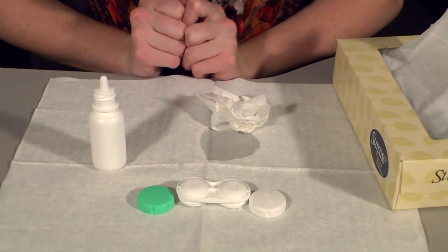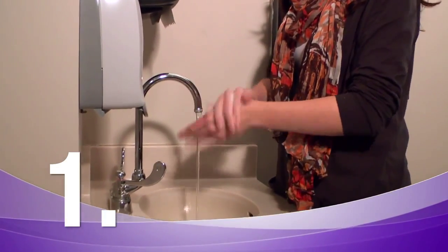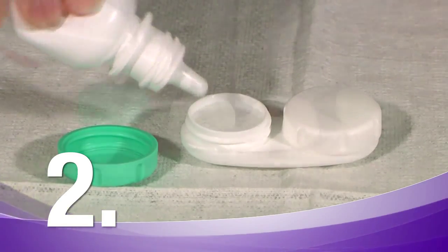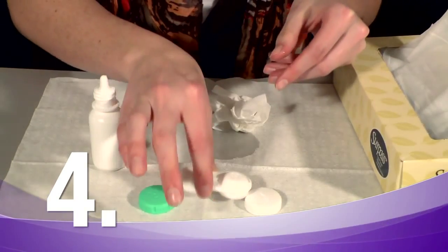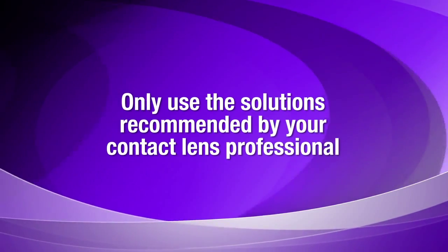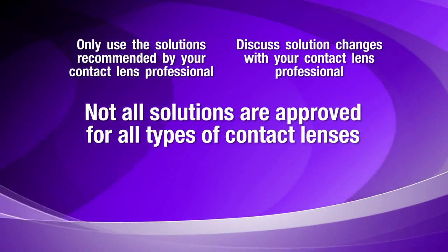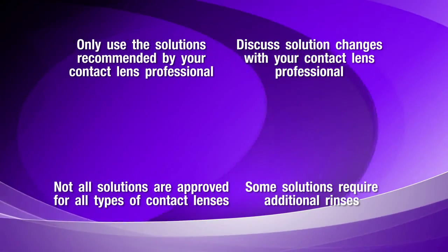Taking proper care of your scleral lenses is easy. Always wash and dry your hands prior to handling your contact lenses. Always use fresh solution in the case and never top off or reuse solution. To avoid contaminating the bottle, be careful not to touch the tip of the bottle with the solution in the case. Rinse the case daily and allow it to air dry between uses. Only use solutions recommended by your contact lens professional; if you want to change solutions, discuss it with them first, as not all solutions are approved for all types of contact lenses. Some solutions require additional rinses after the disinfection process, so read and carefully follow all care instructions.